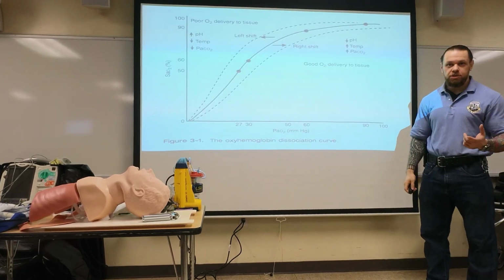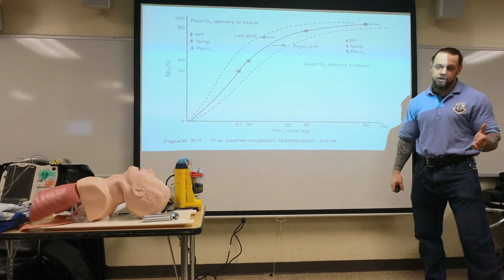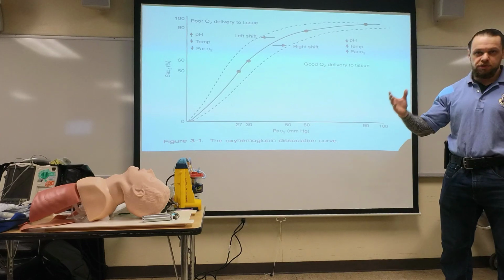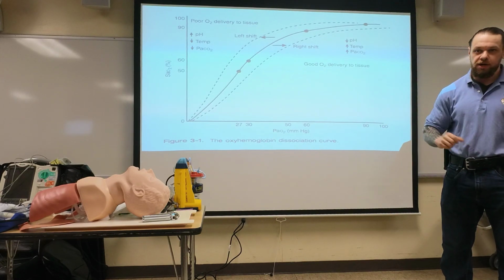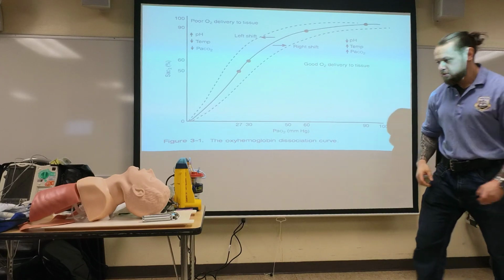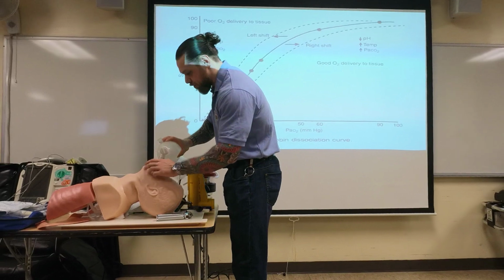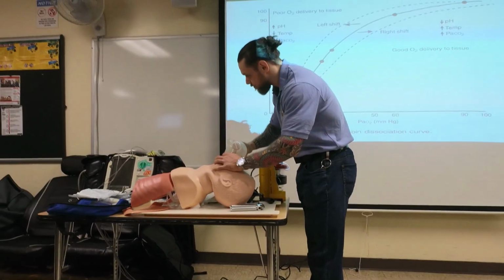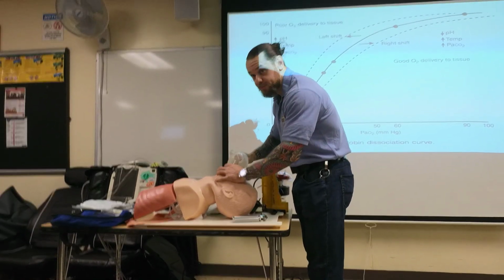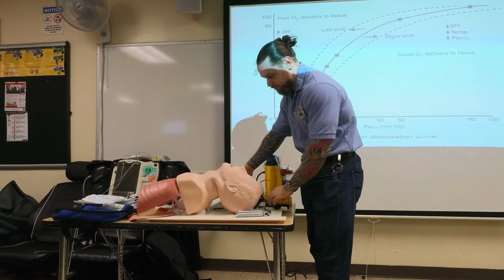We talked about the oxyhemoglobin dissociation curve. So let's say you arrive to the scene and you decide you want to intubate. You tell the BLS providers there, hey guys, I would like you to pre-oxygenate this patient to 100% pulse ox. And they say, we heard you, no problem. I look at the numbers. What's the problem? Left shift.